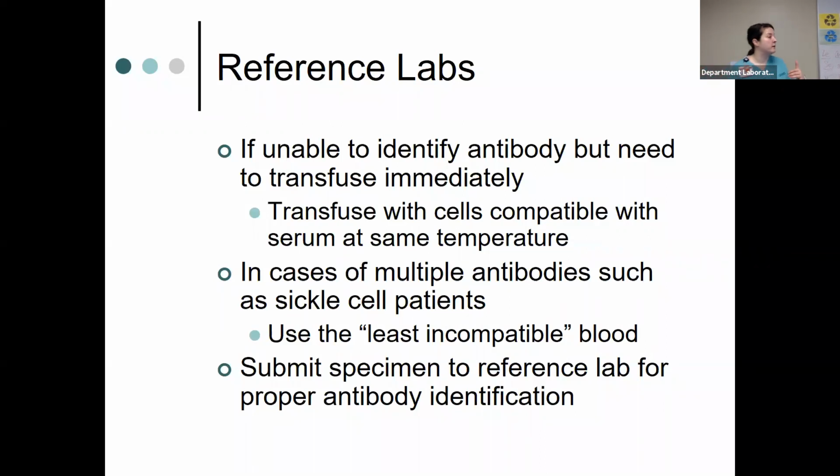So if you get exposed to a Dara patient that looks like a warm auto, that might be something that needs to be sent to the reference lab for confirmation, or you work the patient history, working with clinicians on the treatment side to find out if they have received Dara.